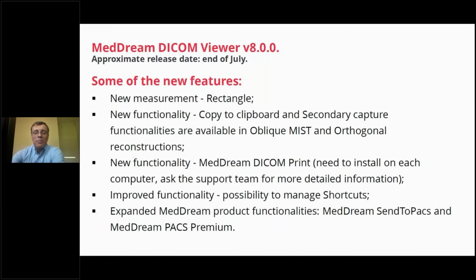Maybe radiologists have, but they need to pass data somehow to other doctors. And finally, we surrendered and made the DICOM print functionality. It will be available in the next release. Our partners who critically need DICOM print can use it, and DICOM print will be included in the standard pricing. There will be no additional charge for DICOM print.